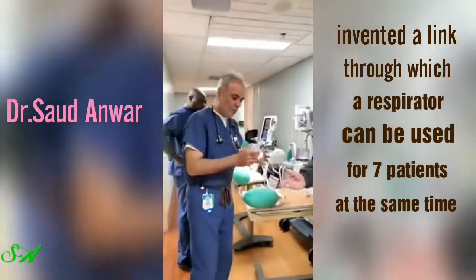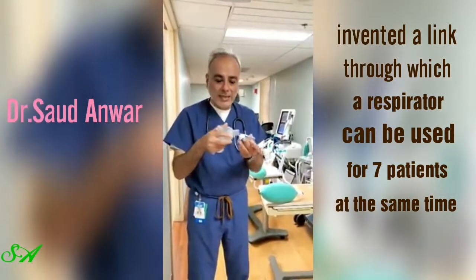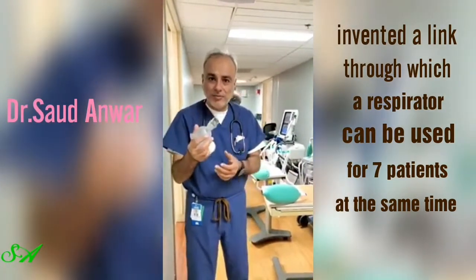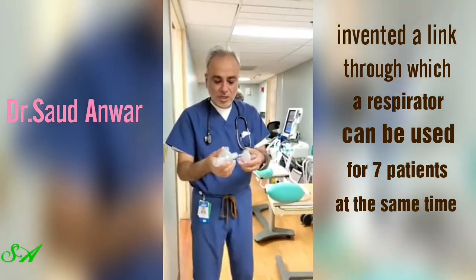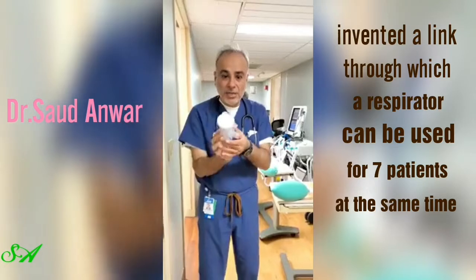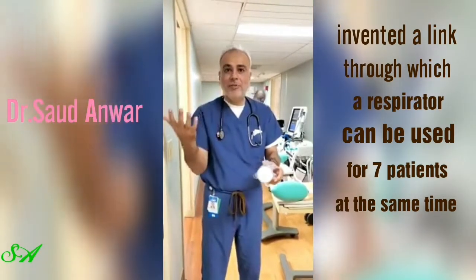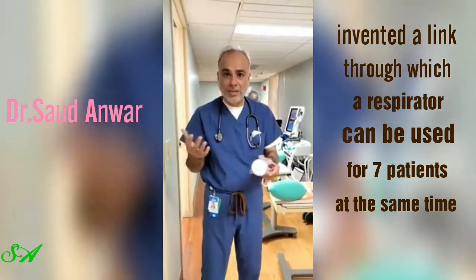Good. So with this concept, this actually goes inside the inhalation as well as the exhalation part of the ventilator. And then these are the filters which can come together. This actually has 4 options. So we can have 4 connectors with one ventilator, and each connector can further be divided into 2 or more branches if we need to.